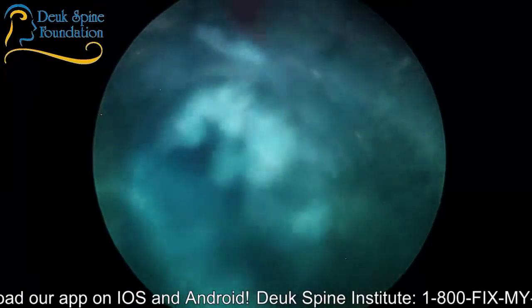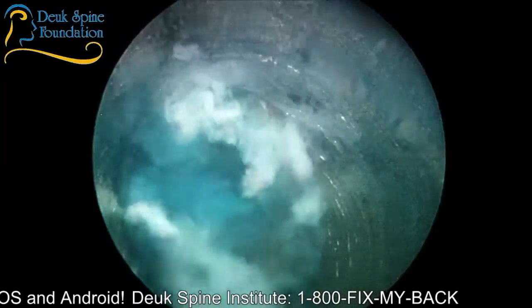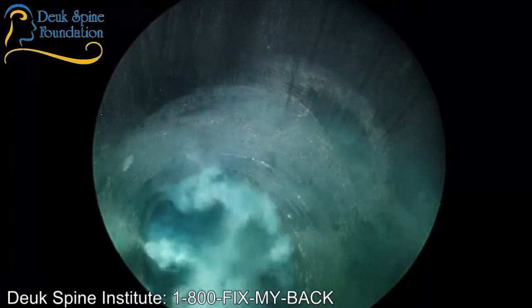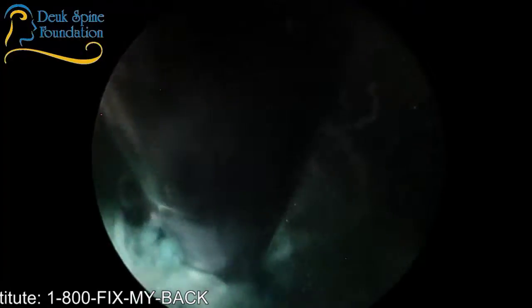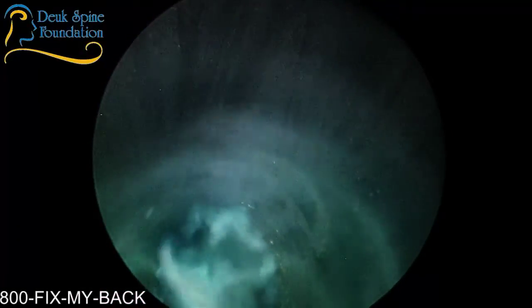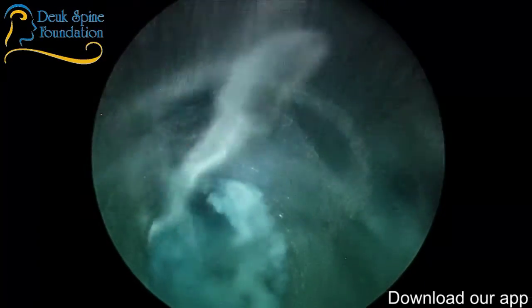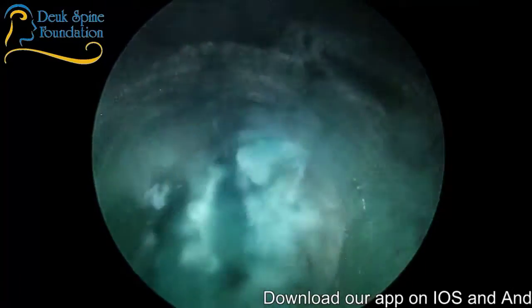Okay, so we're inside the disc. You can see the blue dye. Are you okay with her? Yeah, I'm just checking. I just gotta position her manually so I can make a pretty flower. Do you need me to stop or anything? All right. Good. I would say the most stimulating part is done for this disc until I start pulling the cannula back. She's been very well behaved.